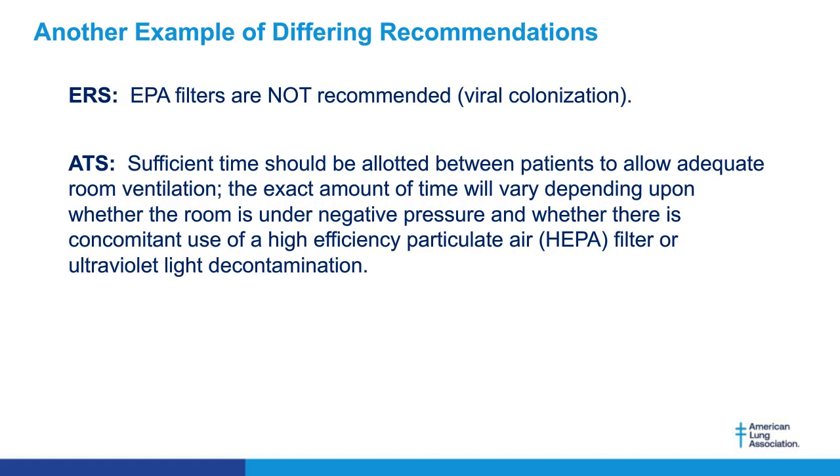It's just another example of the different recommendations. The European Respiratory Society suggests that this should be HEPA filters, not EPA filters. HEPA filters are not recommended due to the possibility of viral colonization of the filter itself. I was told actually that that's really not a concern if the HEPA filter is maintained as it's supposed to be.